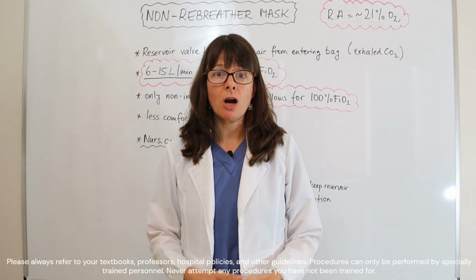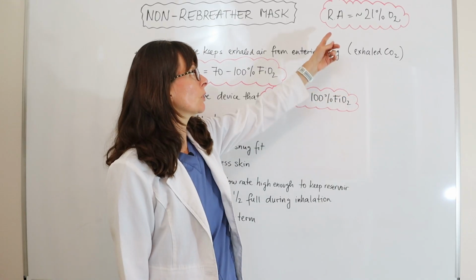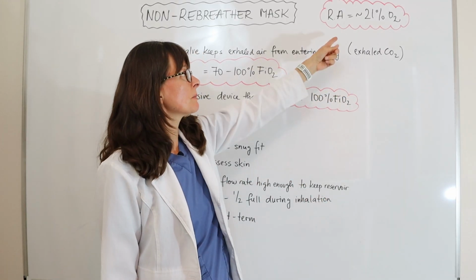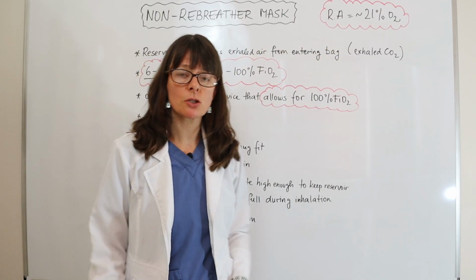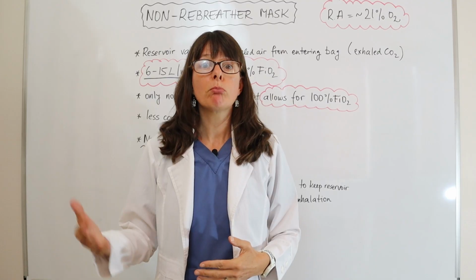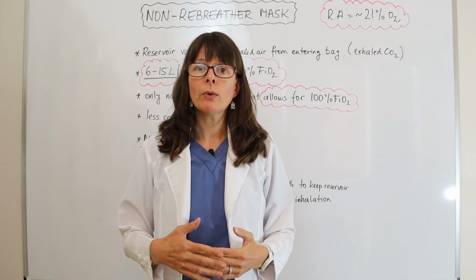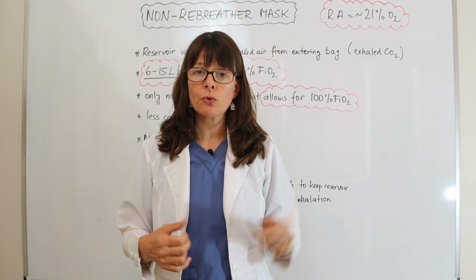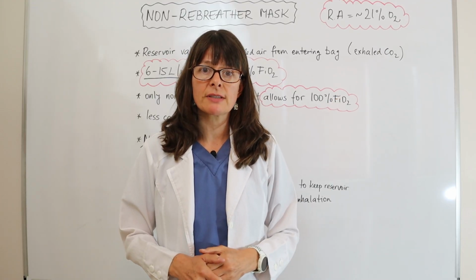Whenever we talk about oxygen, we have to keep in mind that room air, the air that we just breathe every single day, contains about 21% oxygen. So if the patient now, for whatever reason, requires more than that, then we have different delivery systems available that we can use to increase the oxygen that the patient is getting.